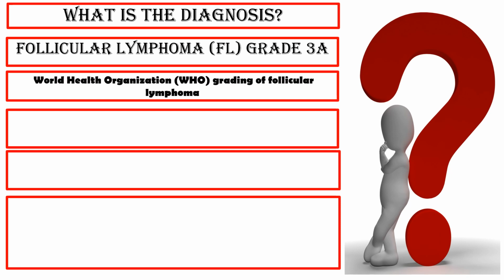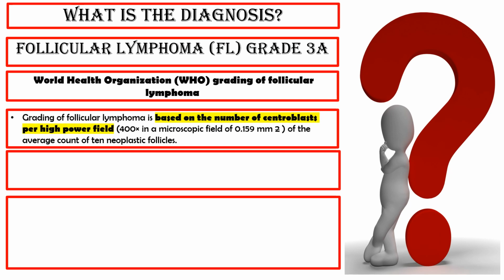WHO grading of follicular lymphoma. Grading of follicular lymphoma is based on the number of centroblasts per high power field of the average count of 10 neoplastic follicles.